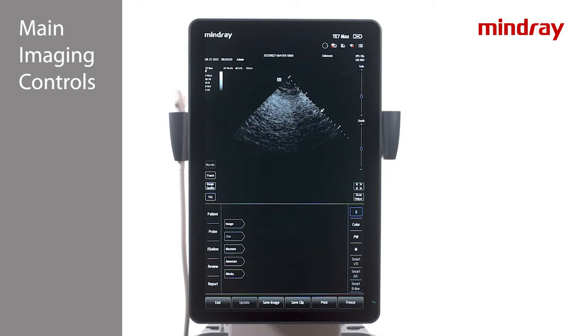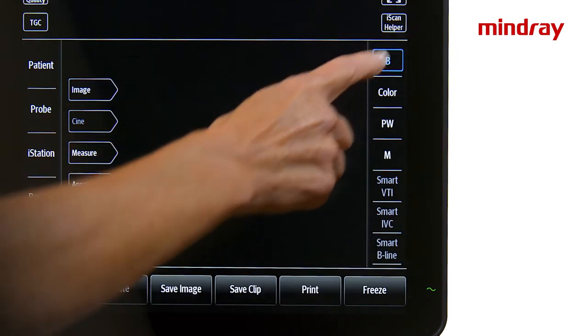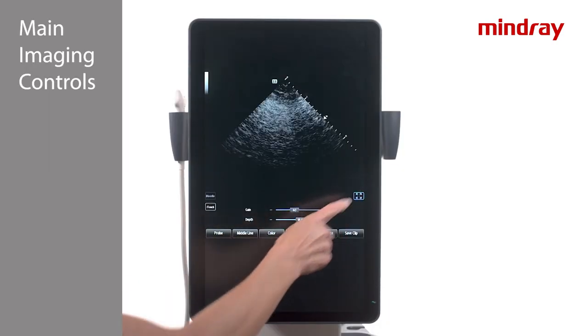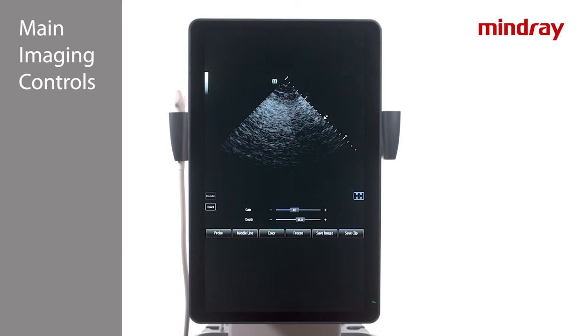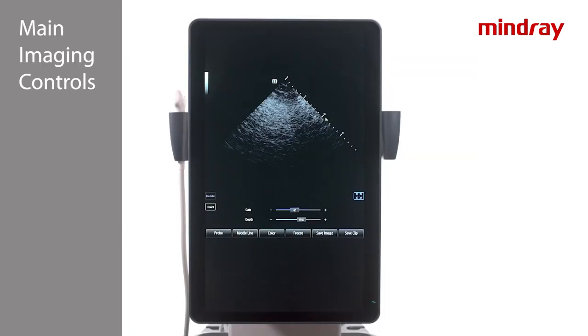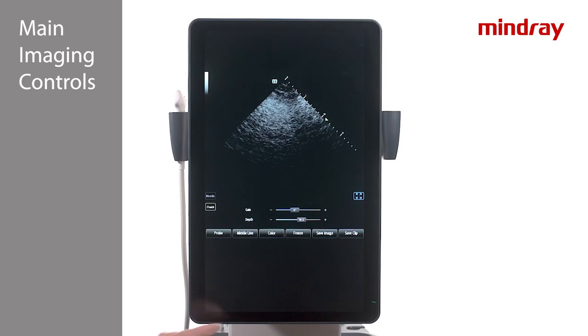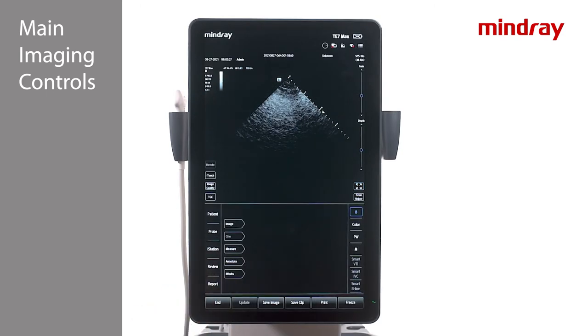To scan in full screen mode, use a finger to swipe down from the black border through the middle of the screen, or press the full screen button on the touch screen. In full screen mode, adjustments may be made to gain, depth, and color, as well as save images and clips and change transducers. To exit full screen mode, swipe up from the bottom middle of the screen.